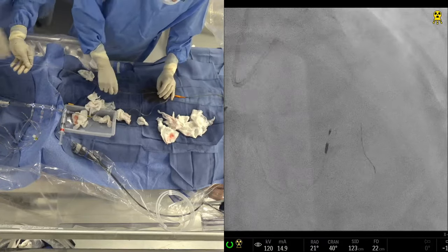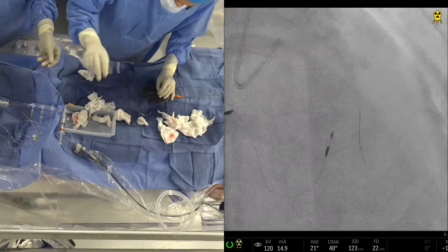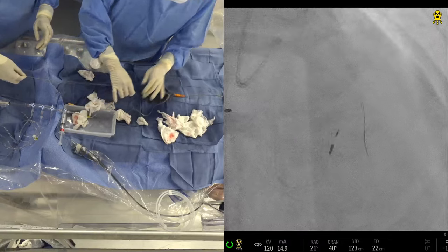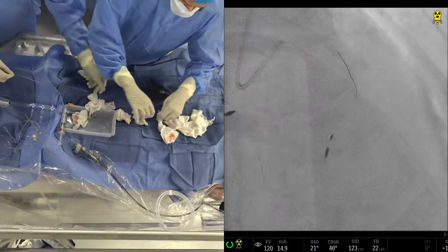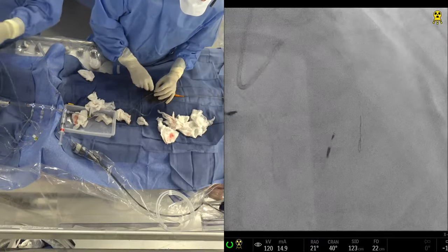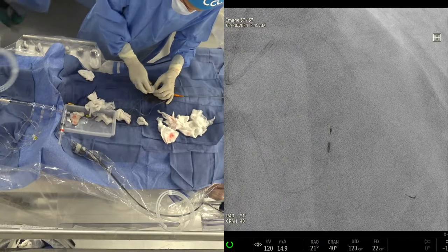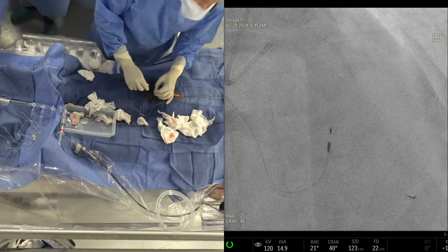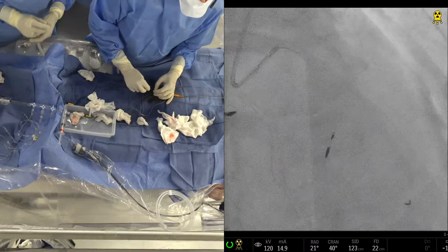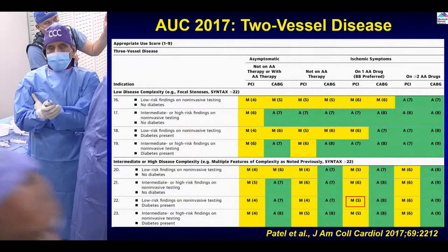So Anu, you want to tell us which wire and which balloon you are going to use, so that I can show my slide meanwhile? She will also have a wire lecture at the end today, because there were some questions last time about which wire. Okay, let's use the same Fielder wire, and first the compliant balloon, or do you want to do the LAD first? Let me see how it goes. I think I will need new wires. The balloon actions here, get a new wire. So we'll go through this.